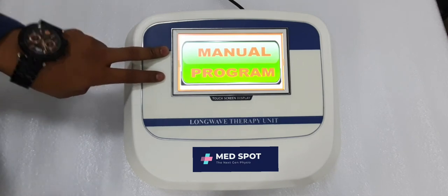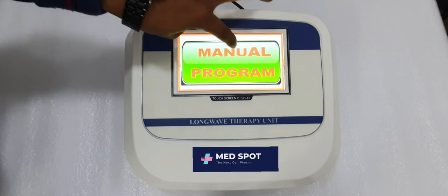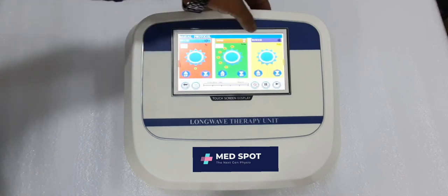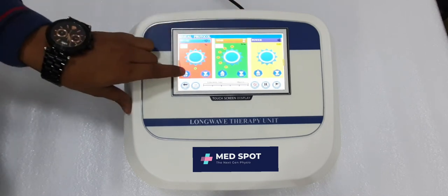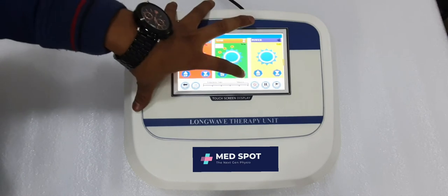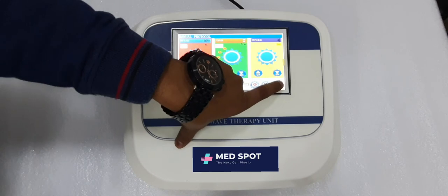It shows you two methods: first is manual mode and second is program mode. For manual mode, simply press this. You'll see pulse time and power settings. First select the pulses, then the duration — the timer for how long you want to treat your patient — then set the power.